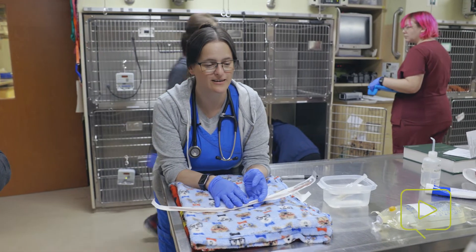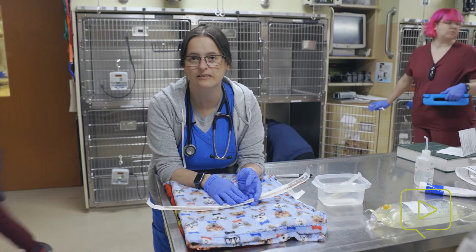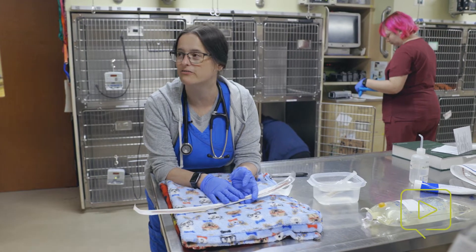I'm Dr. Stacey Montgomery. I'm one of the ER and ICU doctors here at Dove Lewis, and today we're going to talk about tube feeding — specifically a cleft palate puppy, the procedure for setup, how to identify a cleft, and then a quick demonstration of actually feeding these puppies.